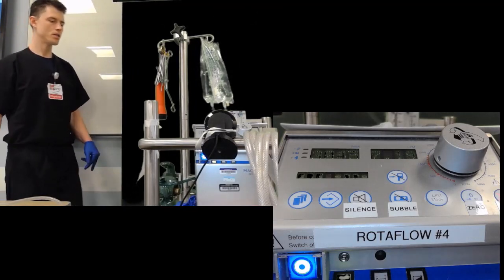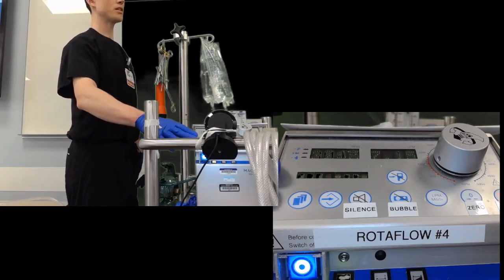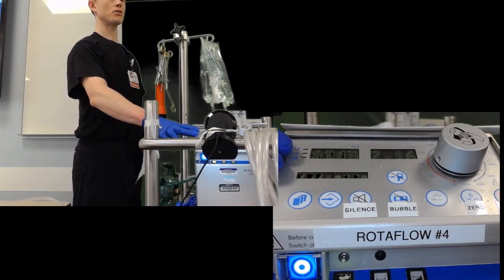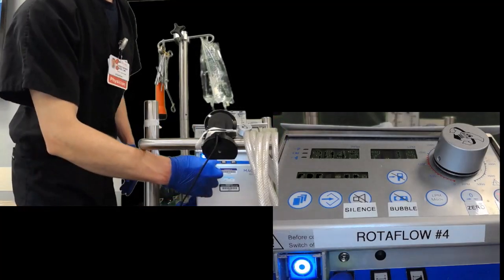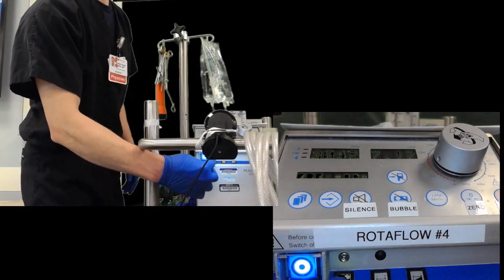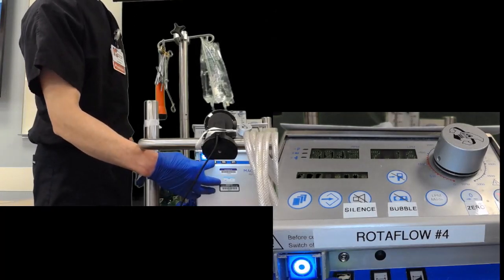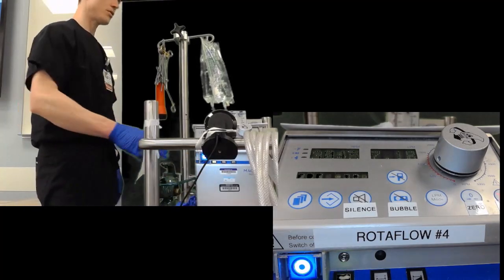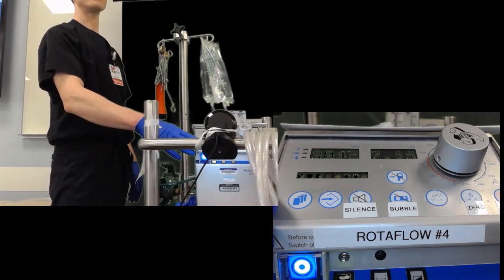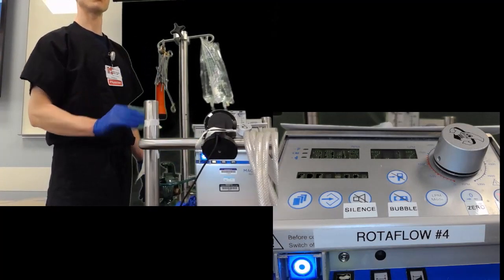And the other thing I'll mention about these, it's really finicky, is make sure that it's plugged in. It's part of the nursing safety checklist to make sure that it's indicating that it's actually getting power. So this green button means it's plugged into the wall and the power source is working, because these batteries can be very old and not functioning well. If the battery dies and there's no wall source, it's just going to turn off without any warning.